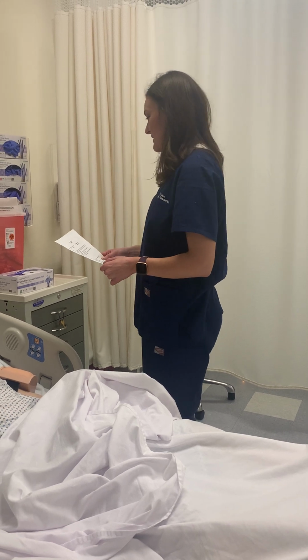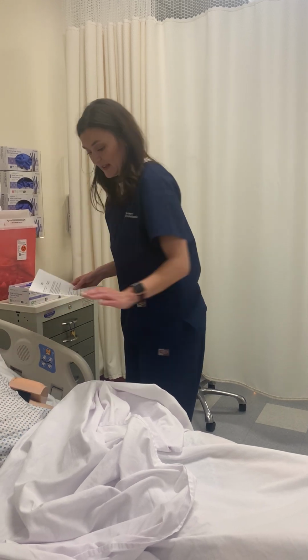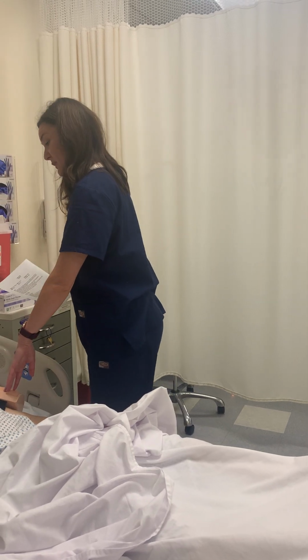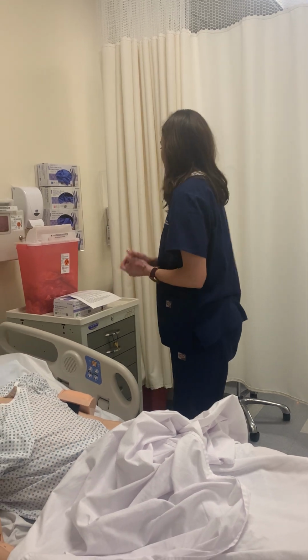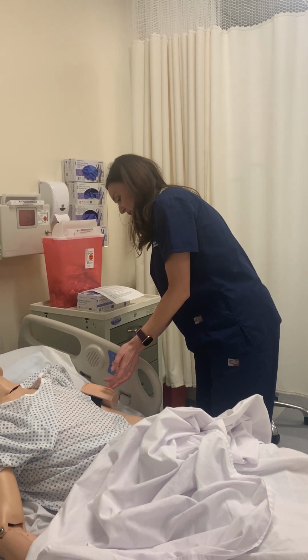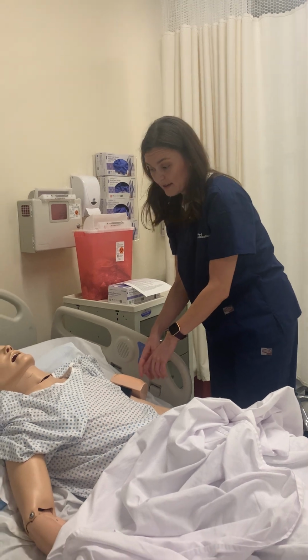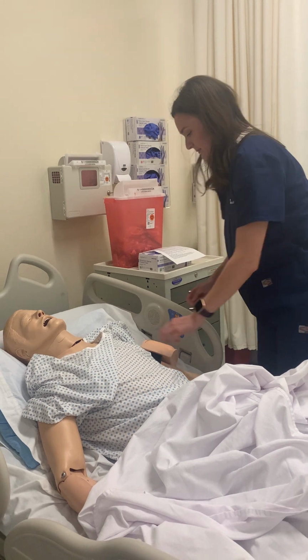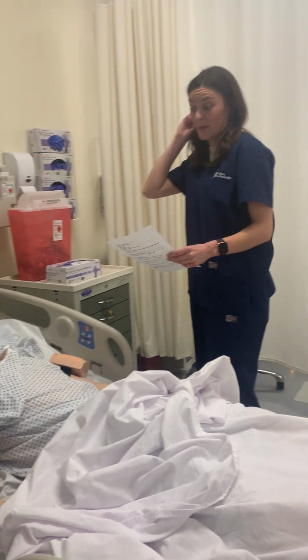Yeah. Okay, very nice. So the IM, it's a muscle injection. So we could give this in your deltoid muscle, we could give this in your ventrogluteal, or we could give it in your vastus lateralis. But the most common is in your deltoid muscle. Is that okay? Okay. So I'm just going to assess your skin site. I'm not going to wear gloves because your skin is intact and clean. So I'm just looking at your skin around your deltoid muscle. Do you have any pain here? No. Okay, and this is on your non-IV arm. Are you having any irritation or anything with your skin? No, not at all. Okay, it looks good. So I'm going to go ahead and go prepare that medication. I will be back in a few minutes, okay?